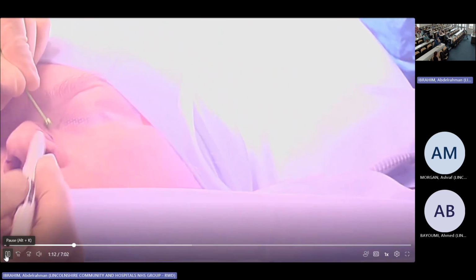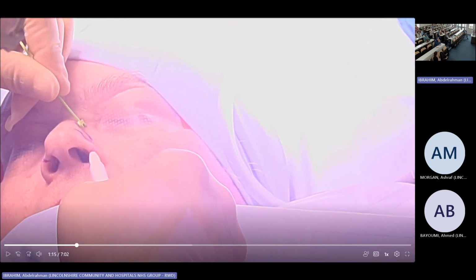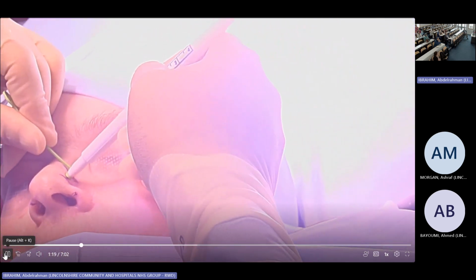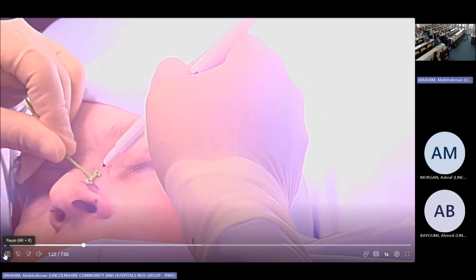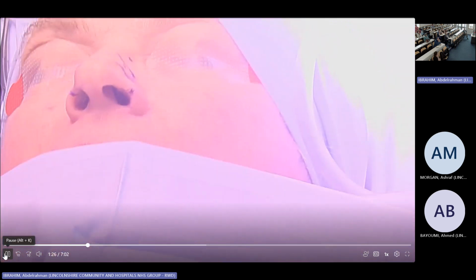The second one, you're going to see it again here. So I mark the bone and I mark the lower lateral cartilage as well. Okay. So the same. The first one will be just, as I said, just above the lower lateral cartilage, and the second one is in the midpoint of the nasal bone. So it will be supported by the nasal bone.